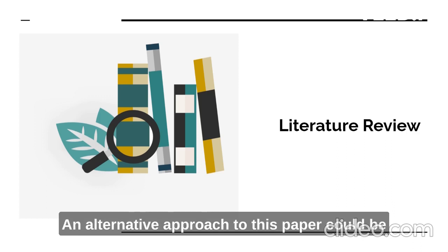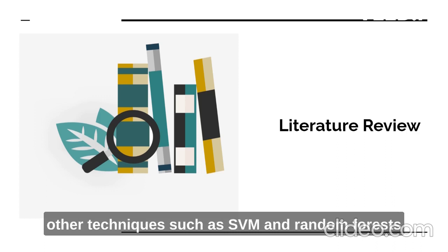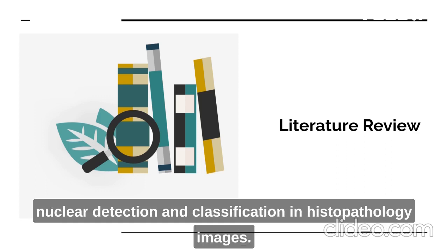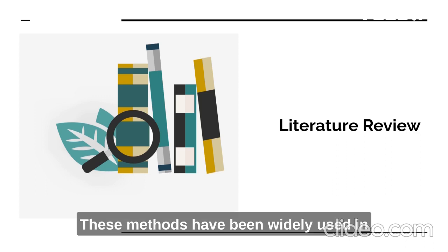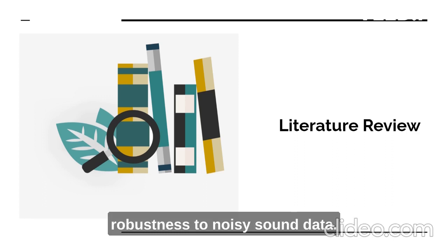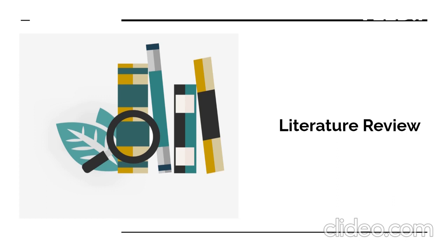An alternative approach to this paper could be other techniques such as SVM and random forests, which can be explored as alternative classifiers for nuclear detection and classification in histopathology images. These methods have been widely used in the field of medical image analysis and offer different advantages such as interpretability and robustness to noisy data.